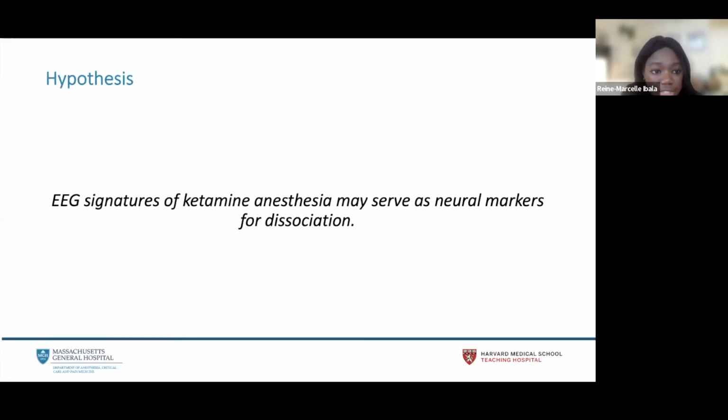So in terms of our study, looking at our hypothesis, we hypothesized that EEG signatures that were associated with ketamine anesthesia may be able to serve as neural markers for dissociation, particularly dissociation as defined by the CADSS model longitudinally.